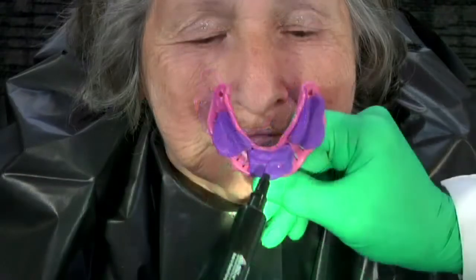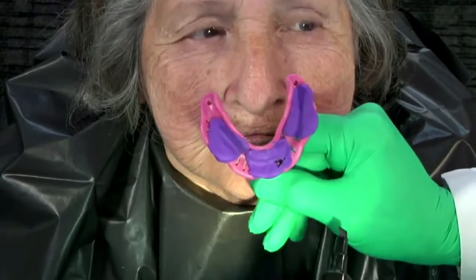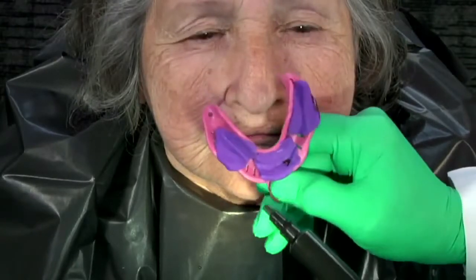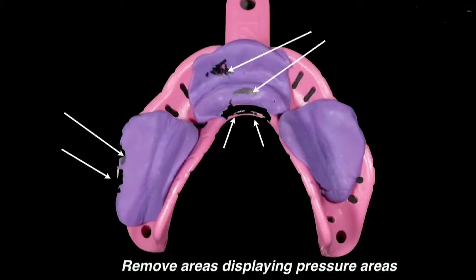Mark any areas indicating pressure. Simply mark the areas to be trimmed with some type of marker. Note areas identified for trimming. Trim all areas marked before proceeding to the next step.